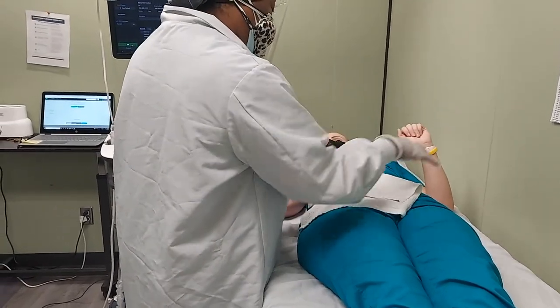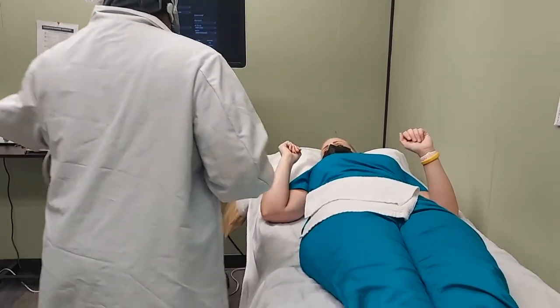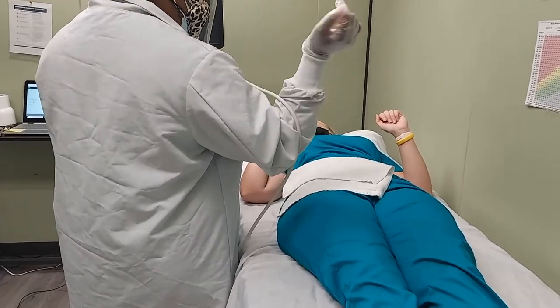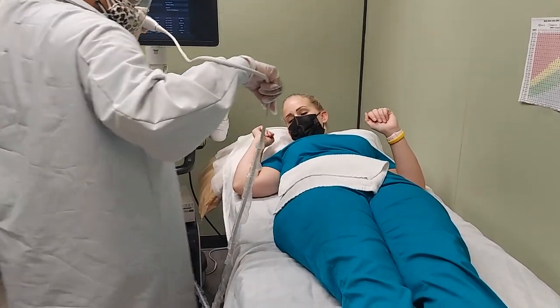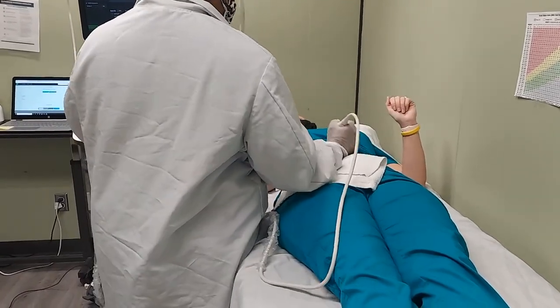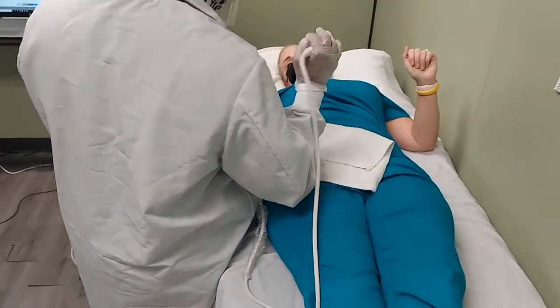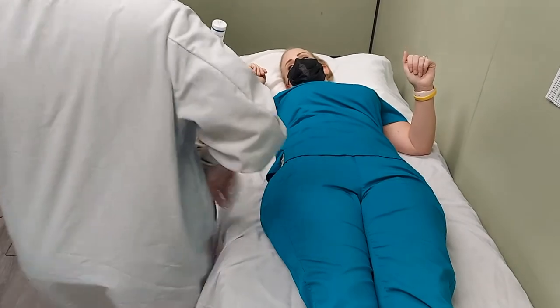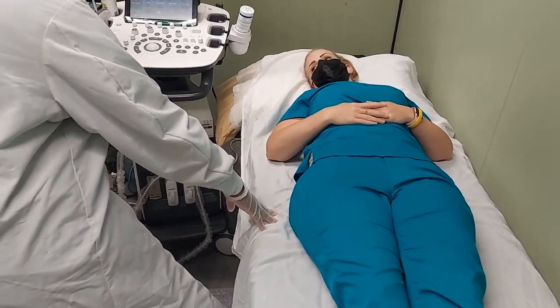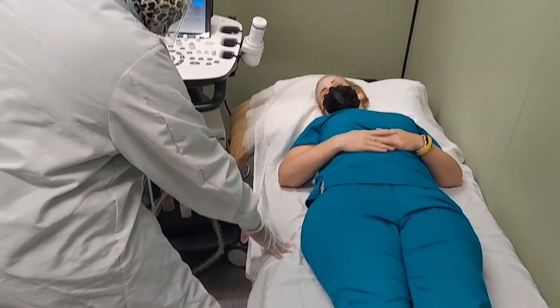This technique is for when you go portable. Raise the bed as high as possible, have your hips up against the bed comfortably. Don't have the transducer cord twisting around your arm — put the probe cord up against the bed and use your hips to hold it so you're not stressing your arm. When you go portable, put a sheet over the patient so you're able to rest on them, and make sure there are no IV cords in that area.